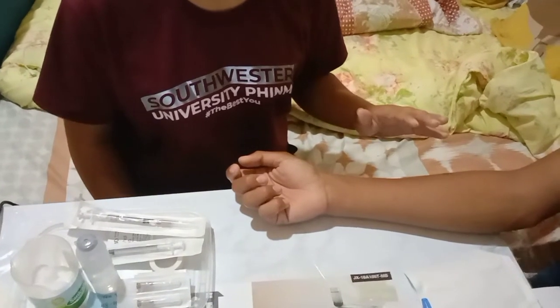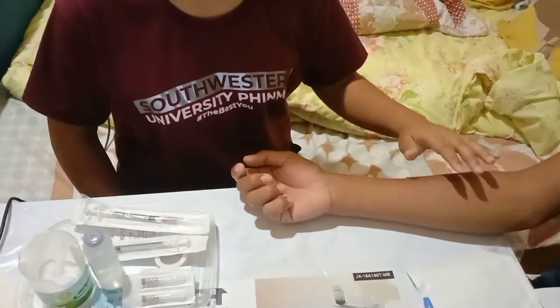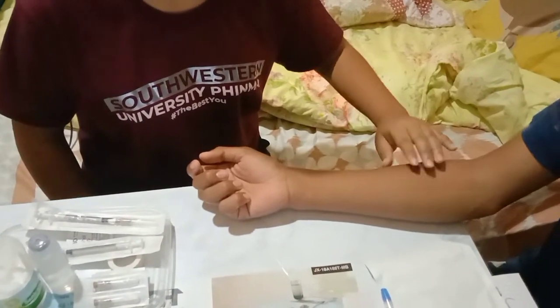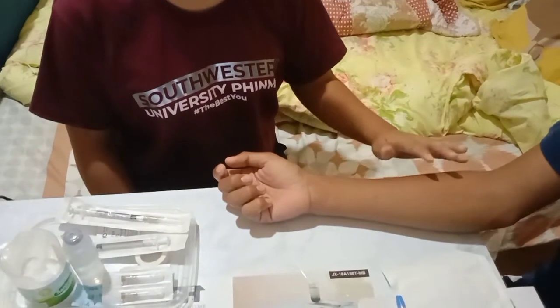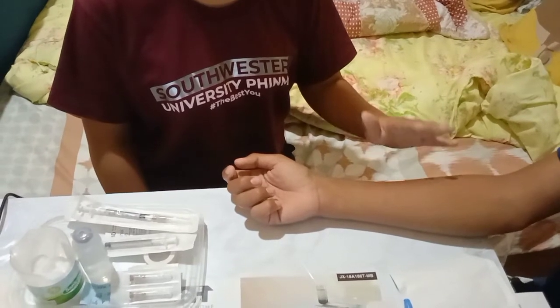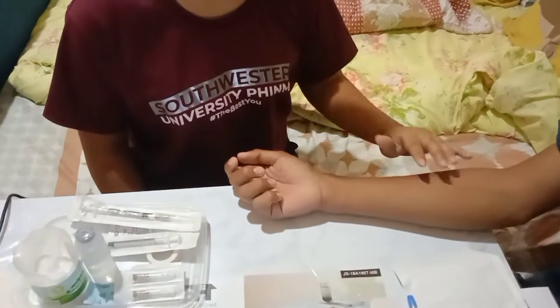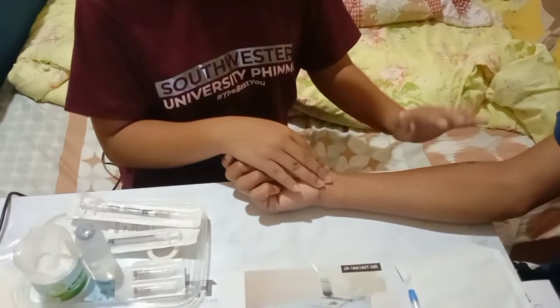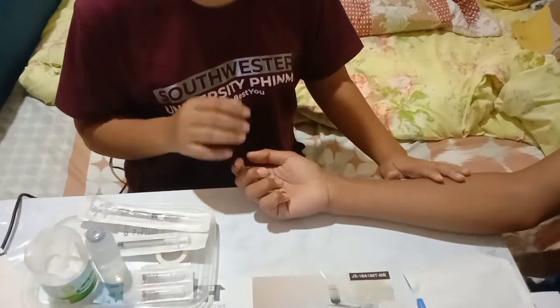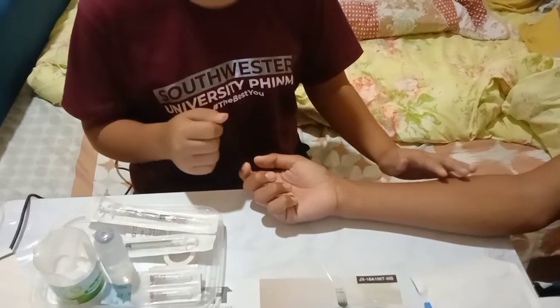Select a clean site. Select a site from the patient, like the forearm. In the forearm, avoid using sites that are tender, inflamed, swollen, or that have lesions. For this client, there are no lesions, and it is not inflamed or swollen. After this, we are going to apply gloves as indicated by agency policy.